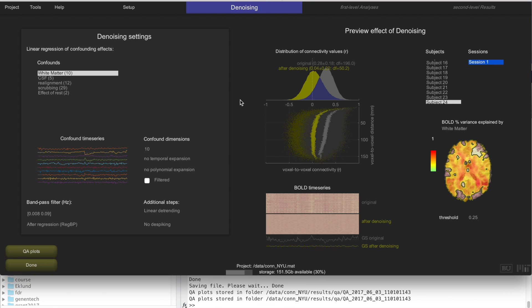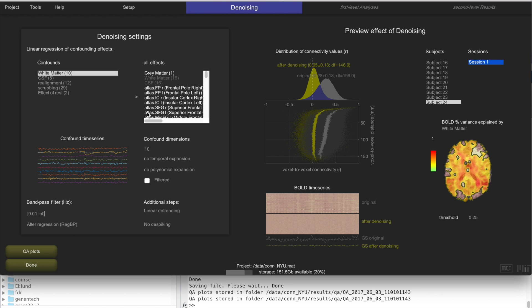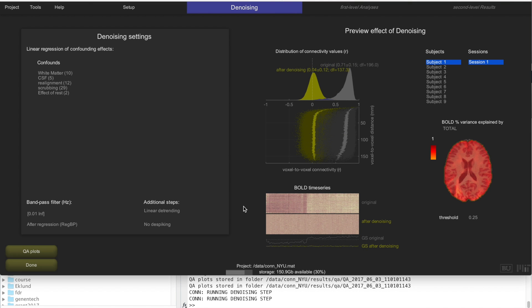This is a good indication that your data is as good as it can be and ready for functional connectivity analysis. Another thing I'm going to change is the bandpass filtering. Even though the default bandpass filtering in many functional connectivity analyses focuses on 0.01 Hz to 0.10 Hz, I want to change that to use just high-pass filtering — 0.01 Hz to inf — to look at high frequencies as well. This also gives more degrees of freedom from the data, improving the quality of denoising and connectivity estimation.